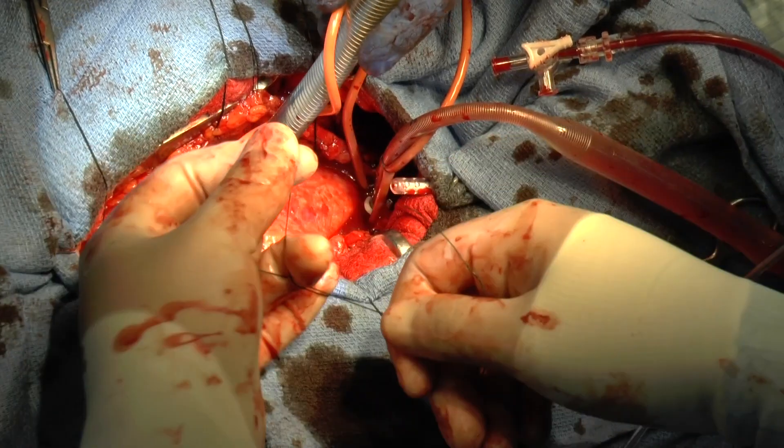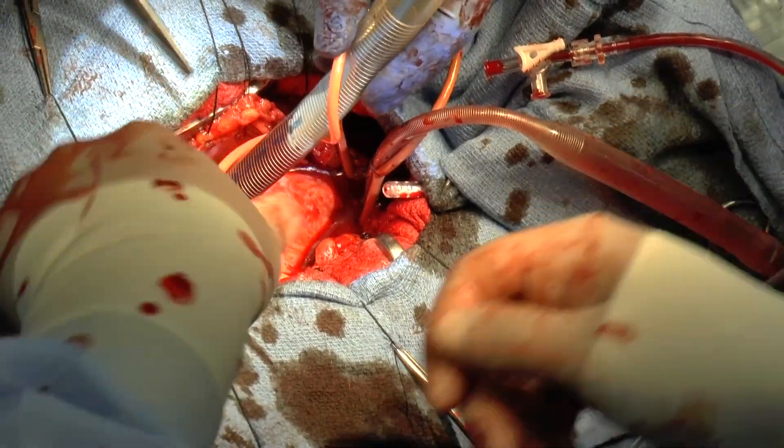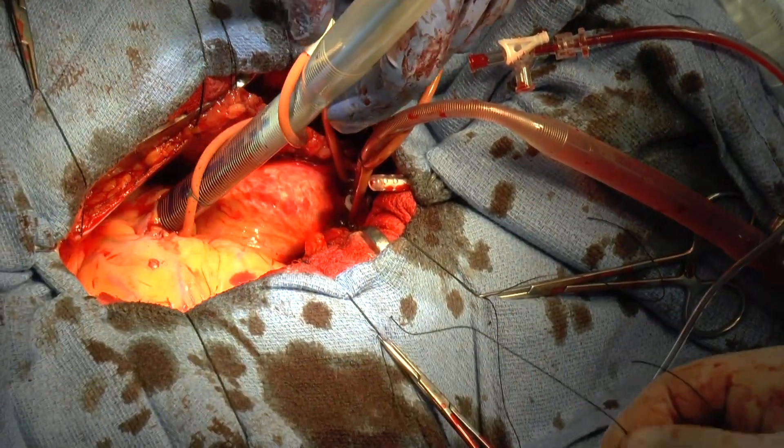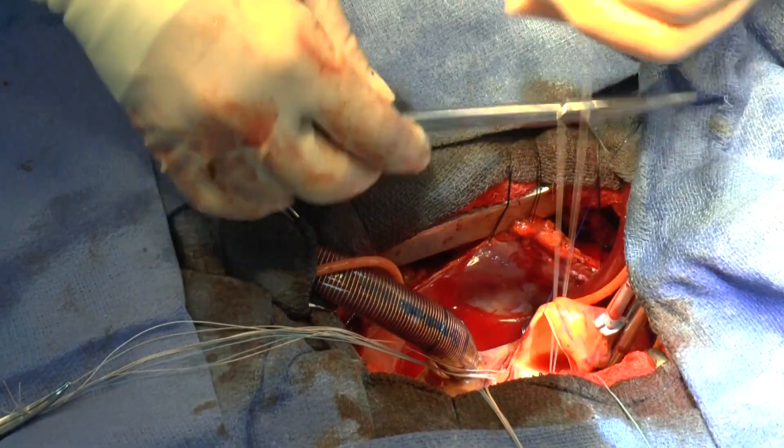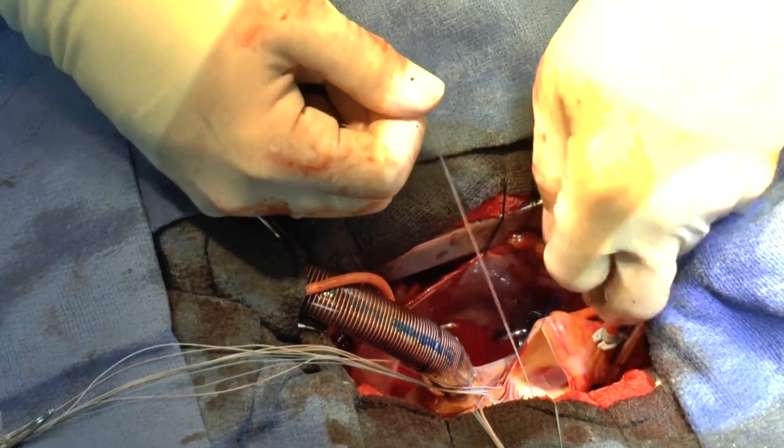This is about how to tie knots in the most effective way. Surgical knots need to be tight enough but not too tight. Tight enough to accomplish their mission but not so tight that the suture breaks or pulls through the tissue.